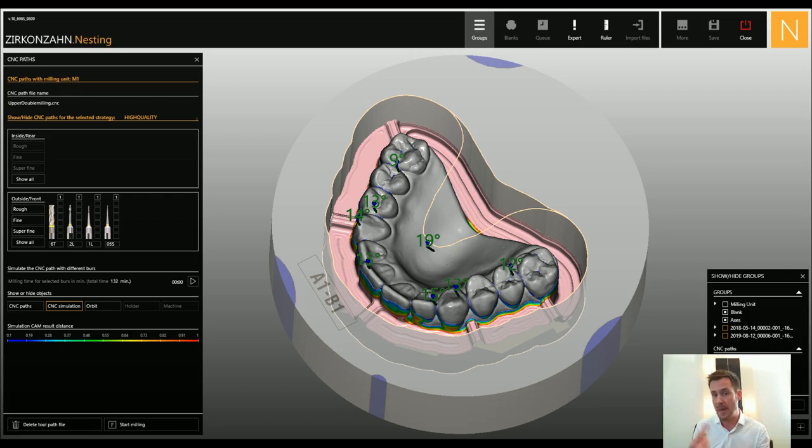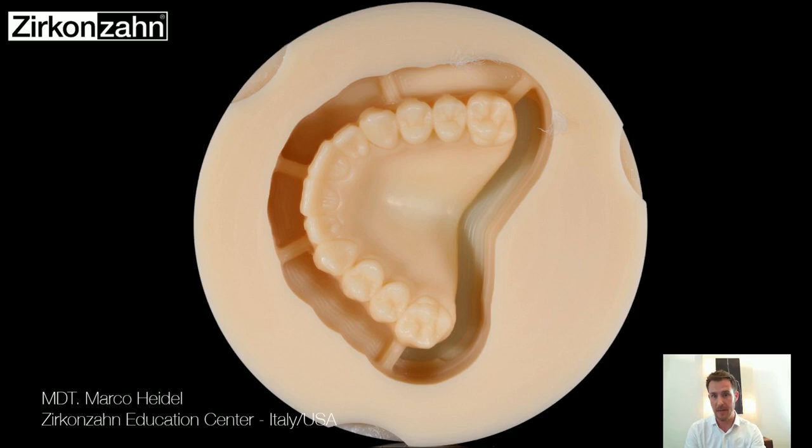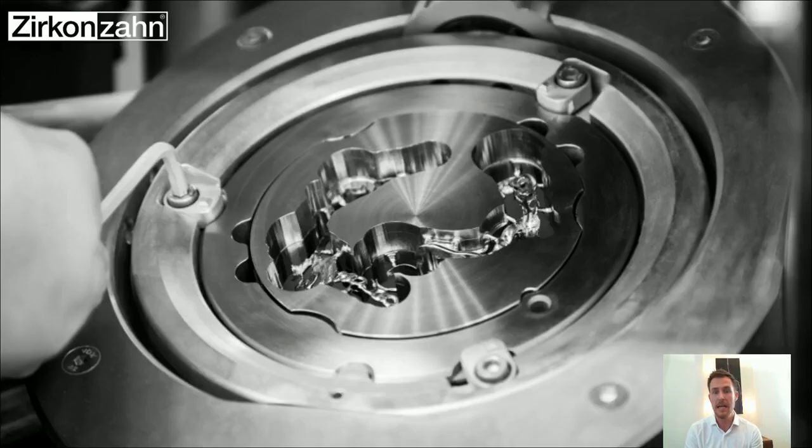So I also have a benefit because I can start with the whole tooth setup days beforehand and mill it already to have it ready for the day of surgery. That means I mill it out already, and it looks like that. The bottom part is not touched at all. And what you have to do is leave it in the milling machine.